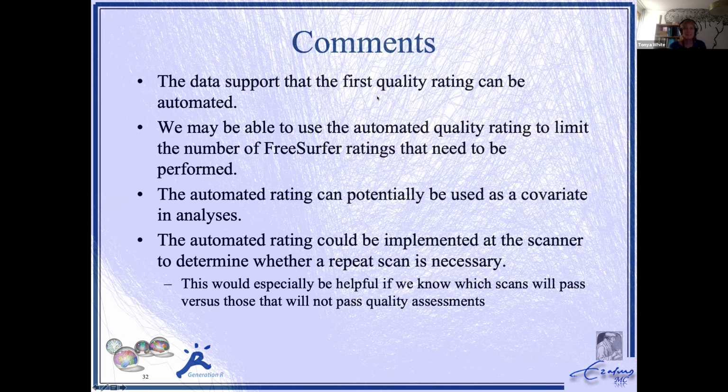So finally, you can have a quality rating scale that can be automated. And hopefully this can be integrated into MRIQC, because there are other algorithms doing this in MRIQC. Rosen from Ted Satterthwaite's group has also used the Euler number from FreeSurfer to show that this works. Or you can combine different measures, and I think MRIQC is doing that now, using some type of machine learning, so that multiple measures give a better prediction.